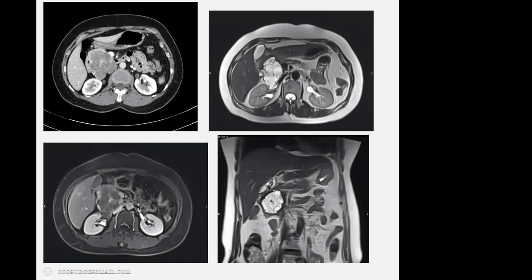They inject a solution containing microbubbles, and inside the body, they generate multiple microbubbles. When we see a specific lesion, like a liver tumor, the enhancement pattern, like enhancing on arterial phase and washout on portovenous phase, we can record the whole event in real time, and it is very safe. It is a bit costly, so it is not very popular in India.